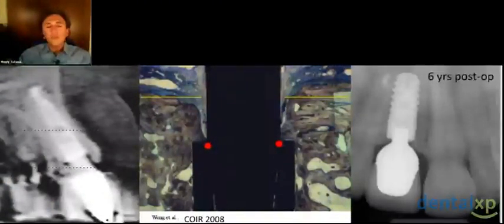What's the future looking at? Many are looking at, this is a paper by Professor Wang that was published in Clinical Oral Implants Research in 2008. And this is very exciting for me in particular, because we can now look at surfaces that are going to be put on the abutment itself, not just on the implant. So with the implants taking the roughened surface above the shoulder, yes, we're getting bone above the shoulder, as you can see on the left part of this histology.